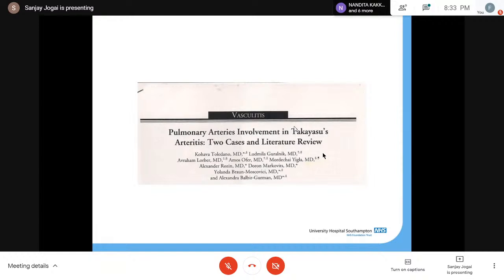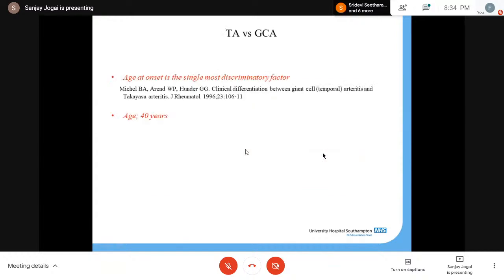So again, coming back to the point which I made in that epithelioid hemangioendothelioma case, I hadn't seen this, and it was clearly something very unusual. So I sent it to another specialist in Cambridge who practices more vascular pathology than we would see, and he wrote a few sentences saying there was nothing against the diagnosis of Takayasu, and this was an isolated pulmonary artery involvement of Takayasu. This is another paper.